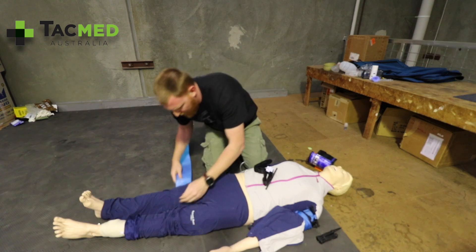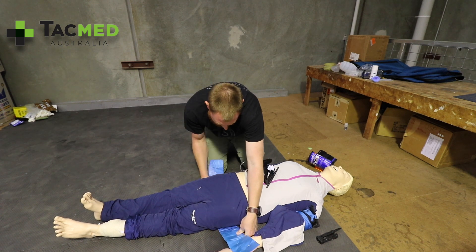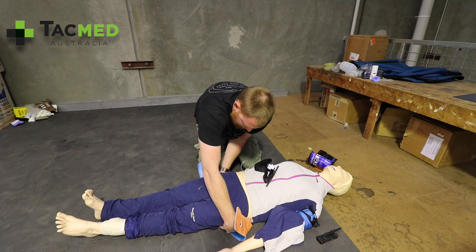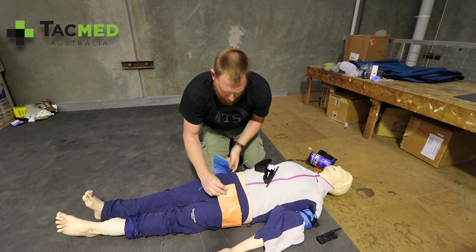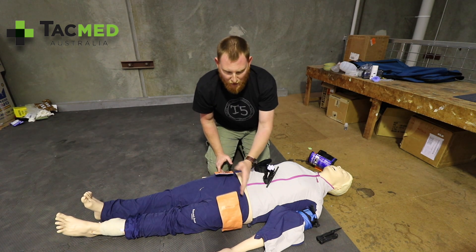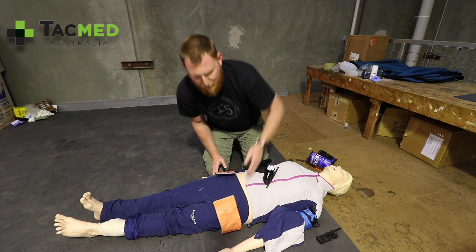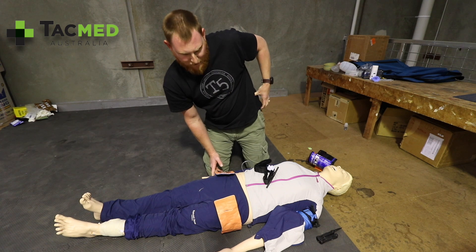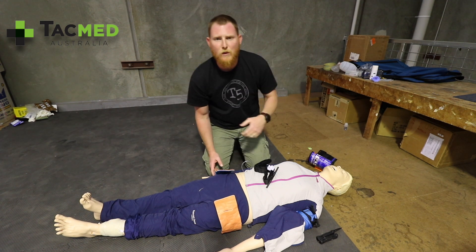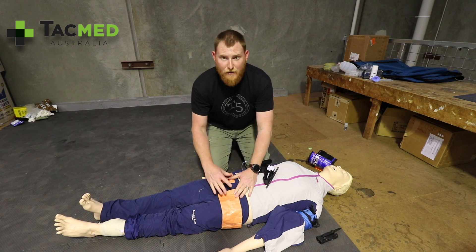Thread it through the small of the back and maneuver the SAM Splint up into the correct position. When putting a pelvic binder or pelvic splint on, we're not going for the hip bones — we're going over the Greater Trochanter. You'll feel a bit of a gap below the Iliac Crest; that's where the head of the Femur is. It almost just goes over where their groin is.